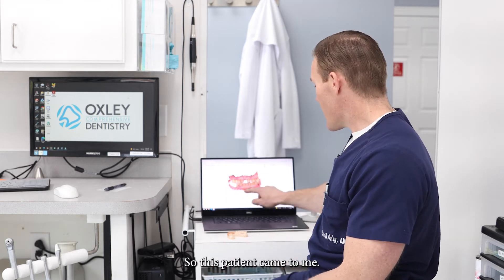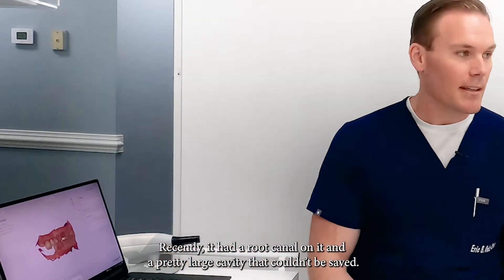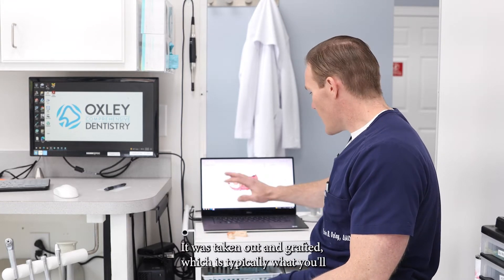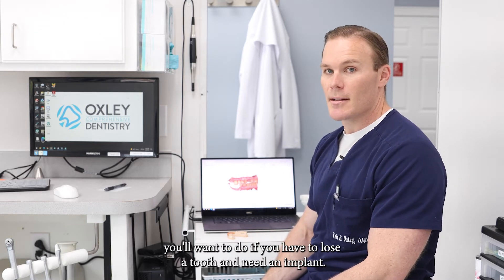This patient came to me having lost a tooth on the bottom right recently. It had a root canal on it and a pretty large cavity that couldn't be saved. So he lost that tooth — it was taken out and grafted, which is typically what you'll want to do if you have to lose a tooth and need an implant.